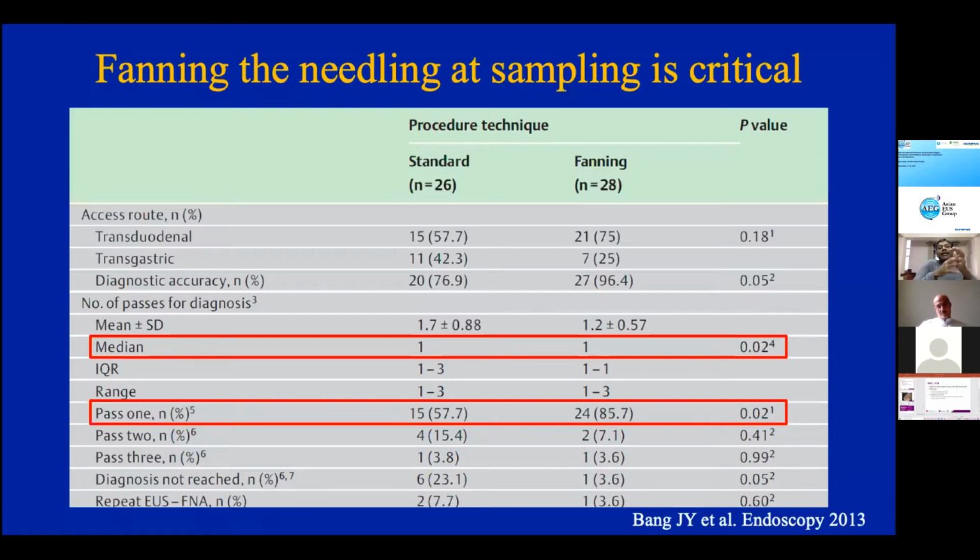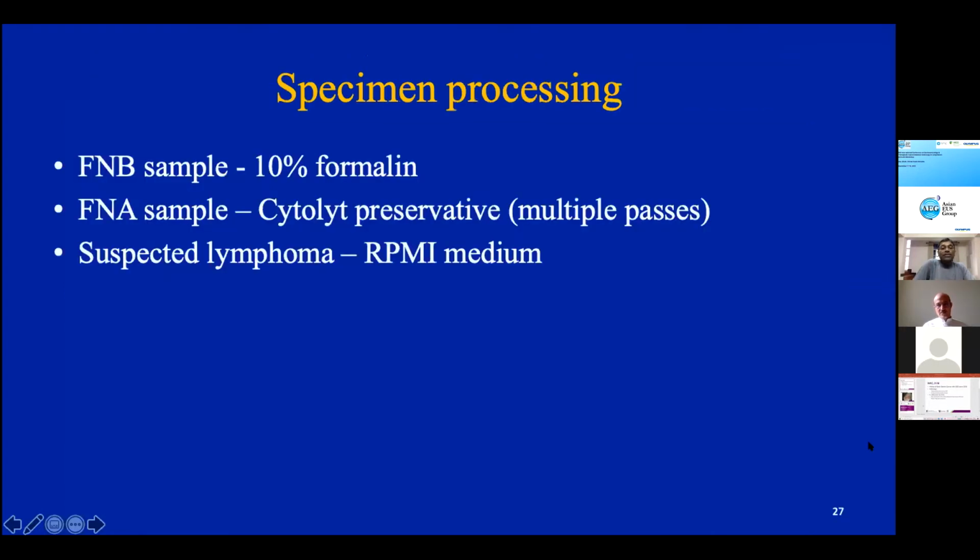And this again is a randomized trial comparing the fanning and the standard technique. You can see that when you use the fanning technique on the very first pass, you will have a diagnosis 86% of the time compared to only 58% with conventional techniques.